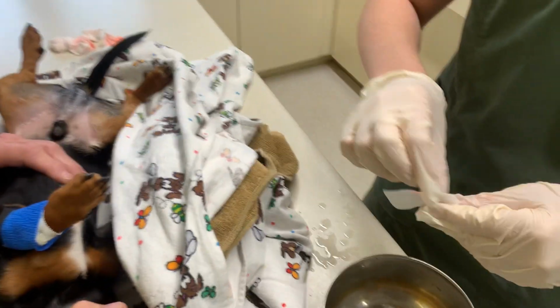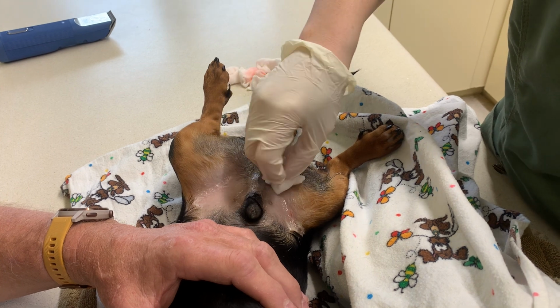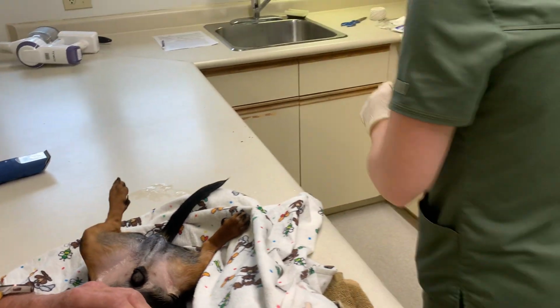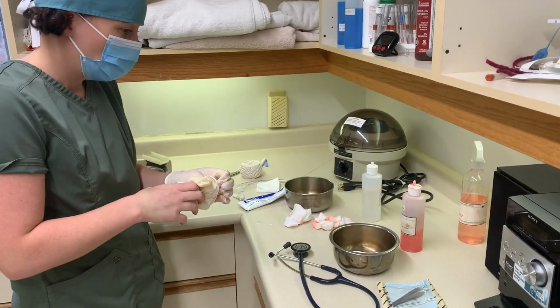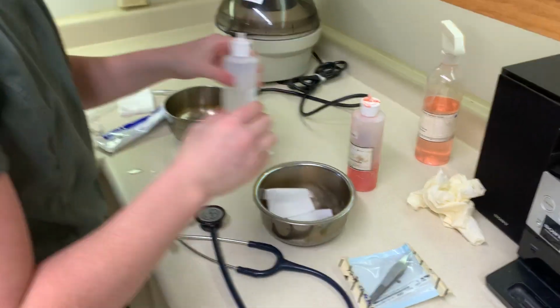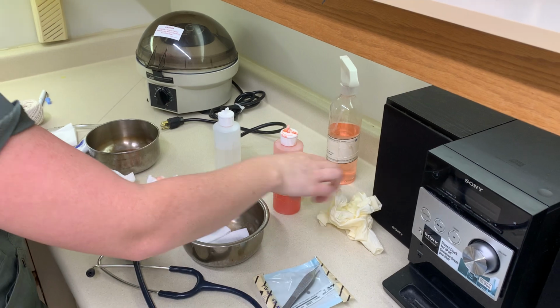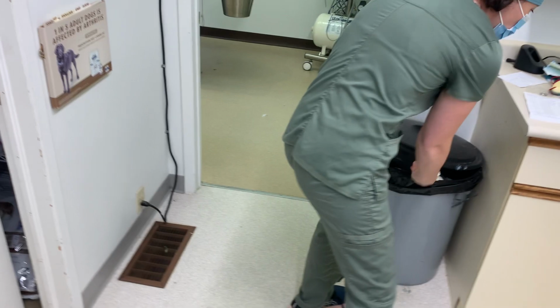And then we're just going to use one more water, rinse that off. Like that. And we're going to put these over here. Now what's going to be important is that we're going to take our gloves off. So we're going to do 2 cleans here. We're going to be doing 1 with alcohol and 1 with alcohol and chlorhexidine. So I'm just going to set all of this stuff aside here in our garbage.